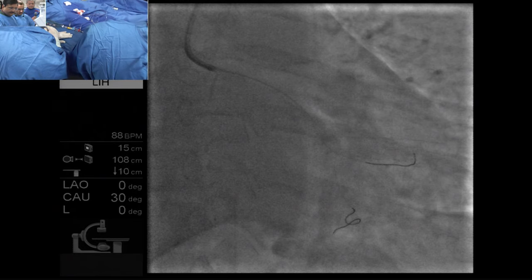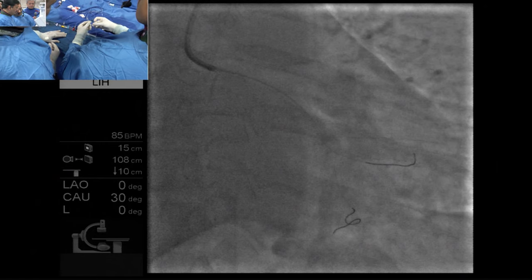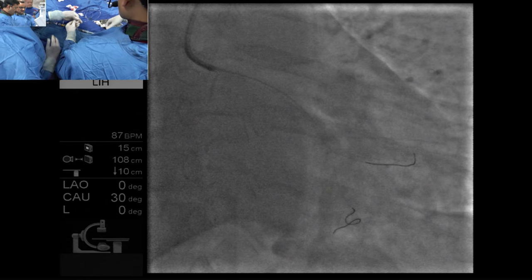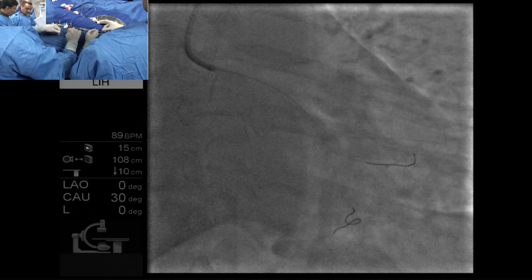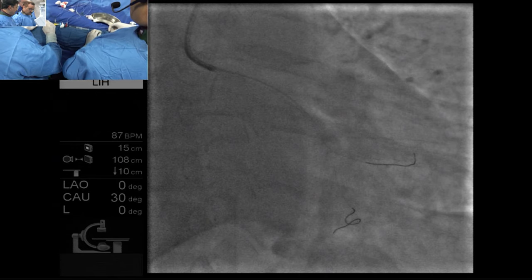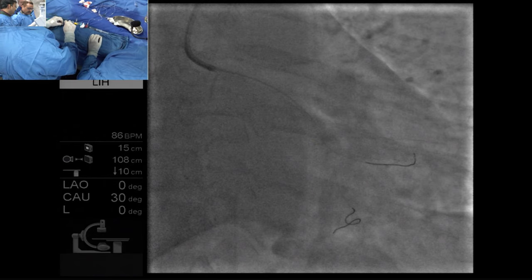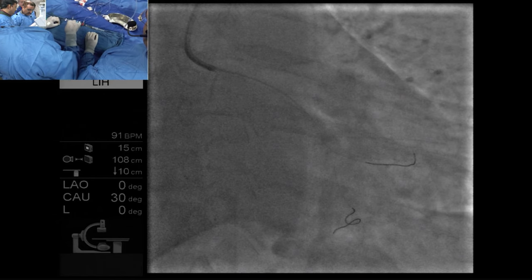Uninflated. Now we're going to use the same 2.0 balloon that we used. I want to wrap it. It's okay. I think it'll go there. That's a non-compliant balloon? Yeah. See, it's the same thing like we used to do angioplasties of 2.0 vessels when we did not have 2 millimeter stents. Deploy the 2.25 or 2.5 at low pressure and then post-dilate with an NC balloon at very high pressure.